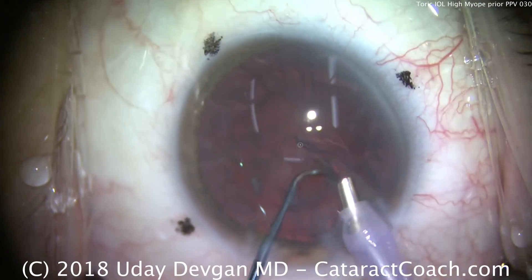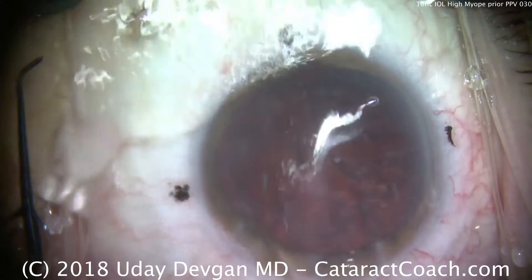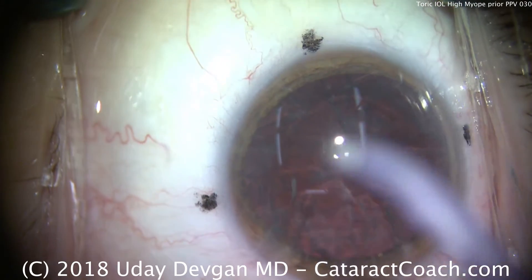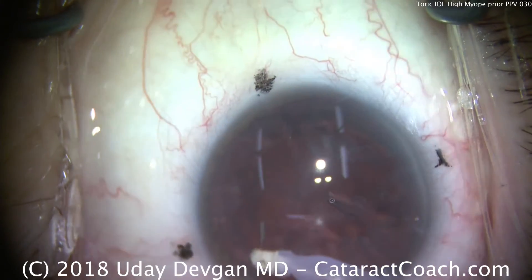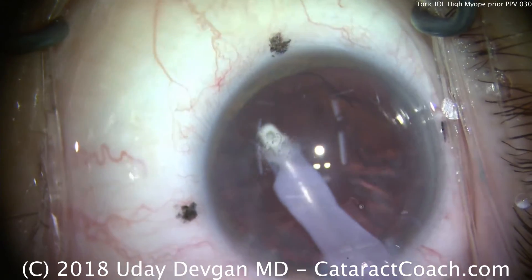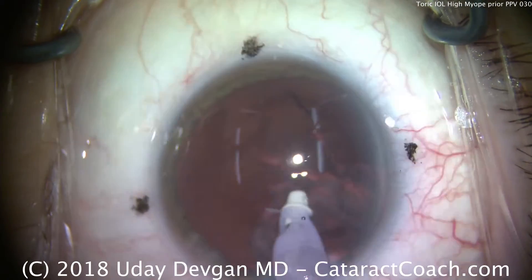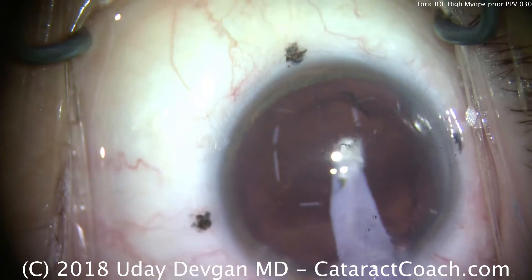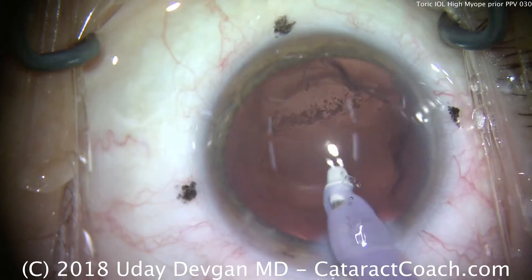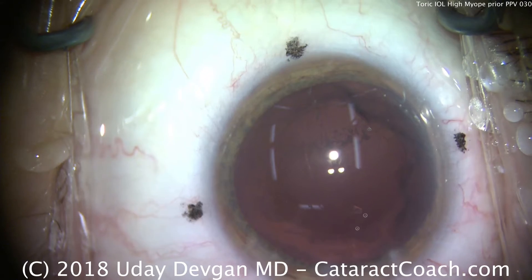All cataract pieces are removed. We're very careful in these eyes — we don't want the AC to flatten too much, so it stays relatively deep between changing out to the IA probe. Sometimes people suspect that barotrauma or pressure changes may relate to traction on the vitreous base, but in this eye there is no vitreous base — the entire vitreous was removed with the prior vitrectomy. We take out the cortex in a circumferential manner. There's certainly no vitreous that can prolapse in case of a capsular bag break, but we want an intact bag because we're putting a toric lens in. In the U.S., we do not have an option for a toric lens that fits in the sulcus.